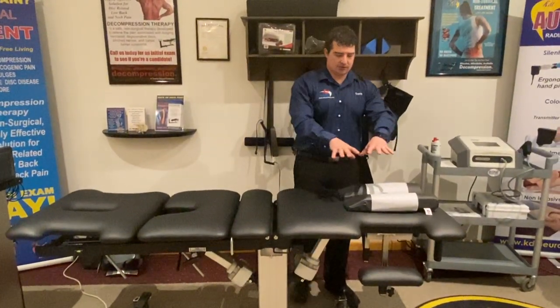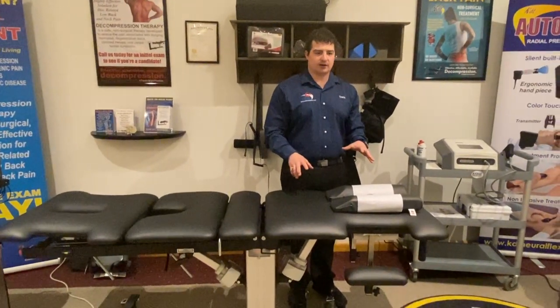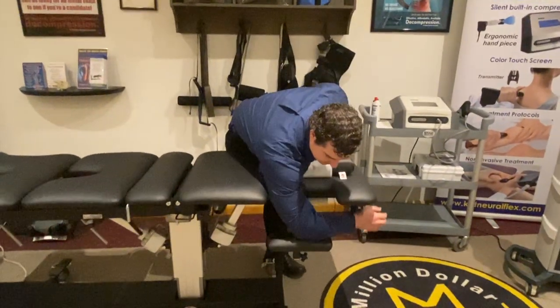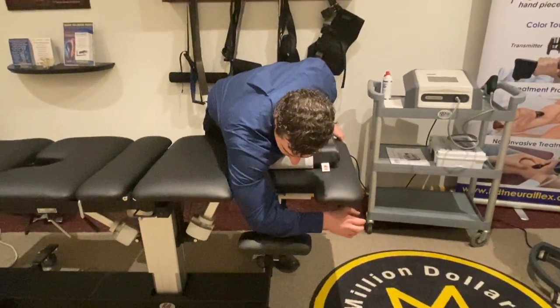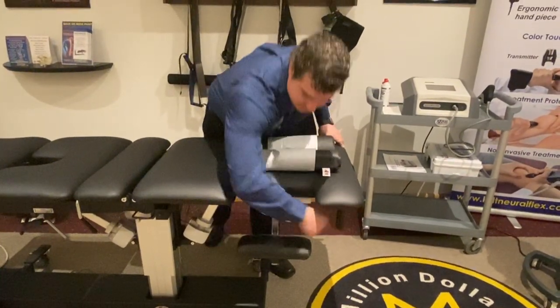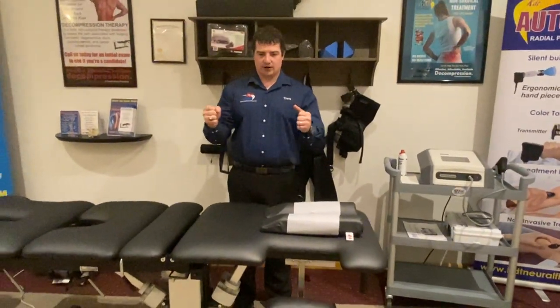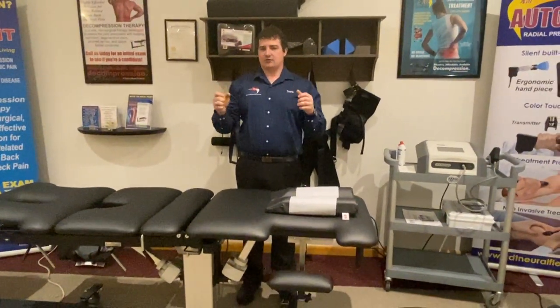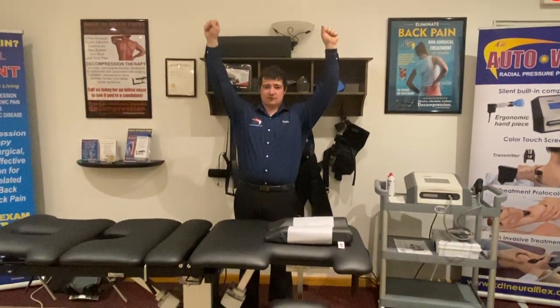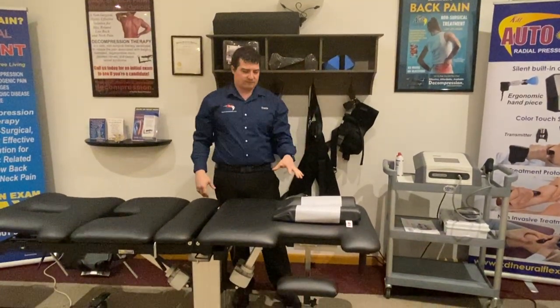The idea was a hammerhead sharp design of the front, which is very unique to this system. The patient's arms are down at the side, so the triceps buttress against the cushion. Then you have the forearm pad and the grab bar, which puts you in a 90-degree bend. It makes your musculature quiescent and very comfortable for the patient. Other systems have arms straight out grabbing grab bars, which creates muscle spasm and irritation.